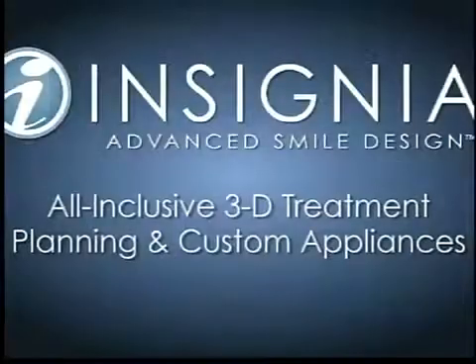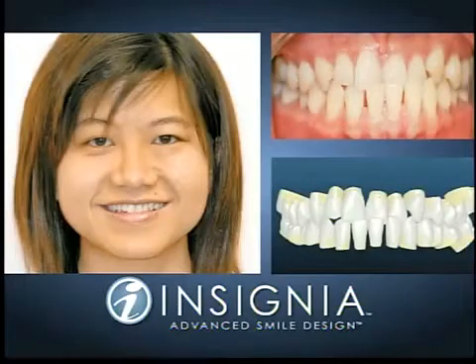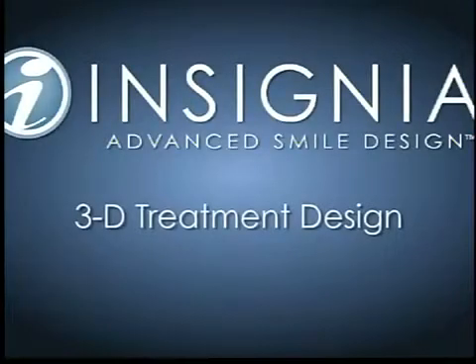We try to stay abreast of all the latest technology, and this is one that I think is really exciting for patients. All right, well, go ahead and explain it to us. I understand you brought a video, and sometimes pictures help a little bit. I did. I think seeing the video will help understand a little bit better. Okay. So what we're going to see here is this patient came in. We take extensive records. They're scanned into a computer, and then it creates a 3D model.